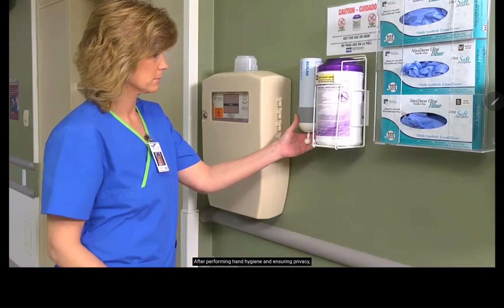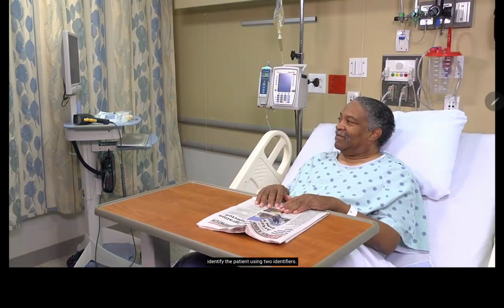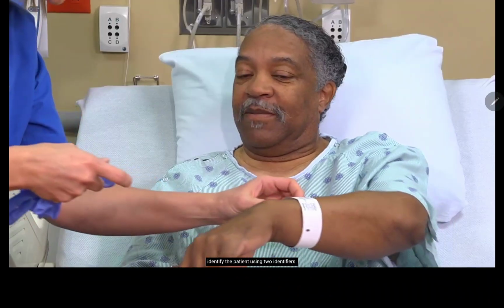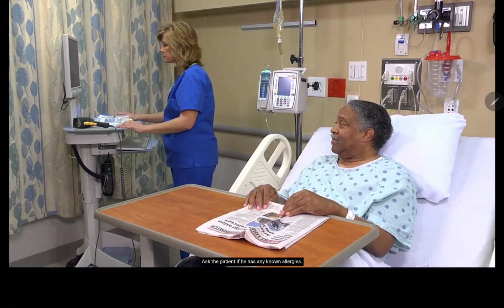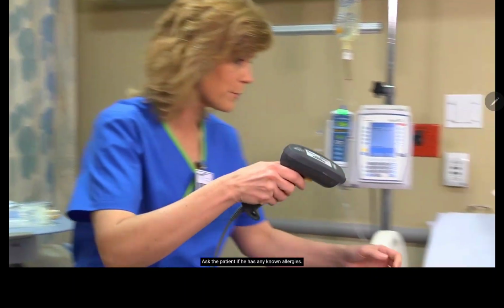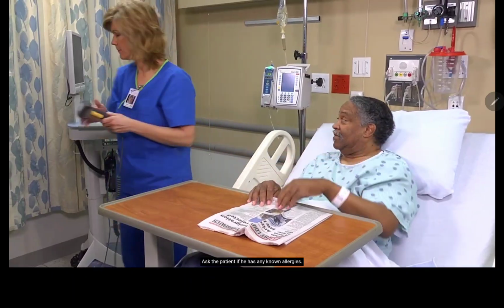After performing hand hygiene and ensuring privacy, identify the patient using 2 identifiers. All right, can you state your name for me, please, sir? William Turner. All right, and your birthday? 3/16/47. Ask the patient if he has any known allergies. Can I scan your armband, please? Thank you.